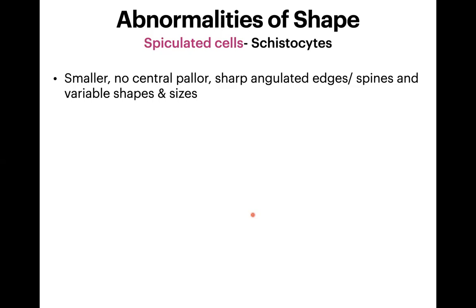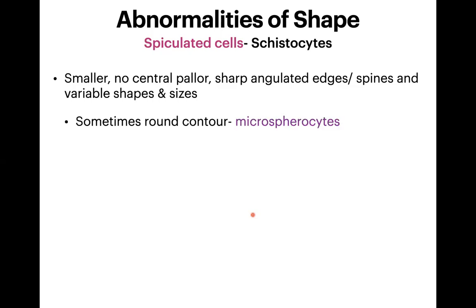Schistocytes mostly have sharp edges and spines, but sometimes they can also have a round contour — like microspherocytes. However, consider them microspherocytes and schistocytes only when the other abnormal-shaped cells are also present on the smear.